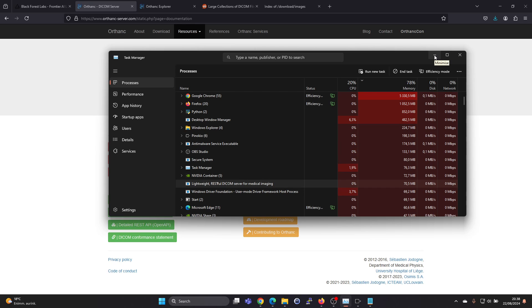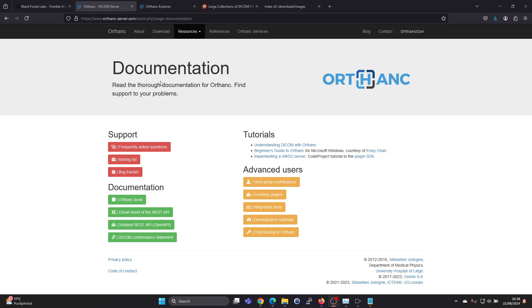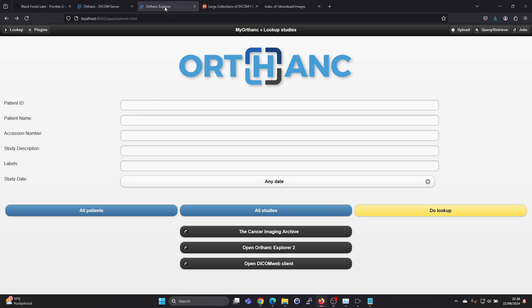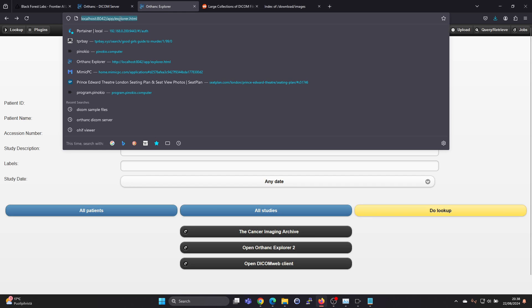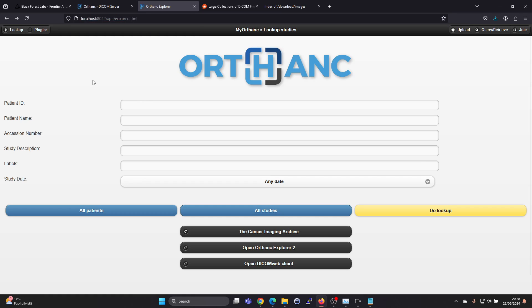And the actual user interface is a web user interface. So in the start menu you should find a link for Orthanc Explorer. And this is the address localhost port 8042. And here you will find the user interface.